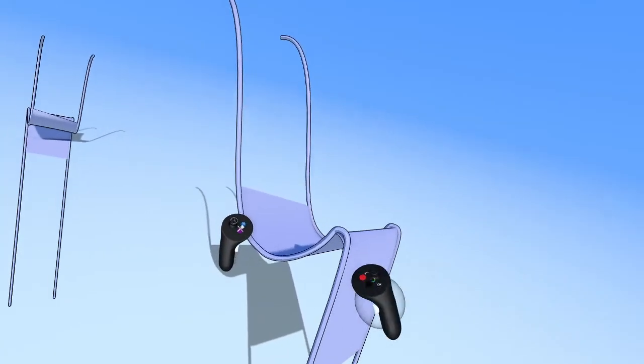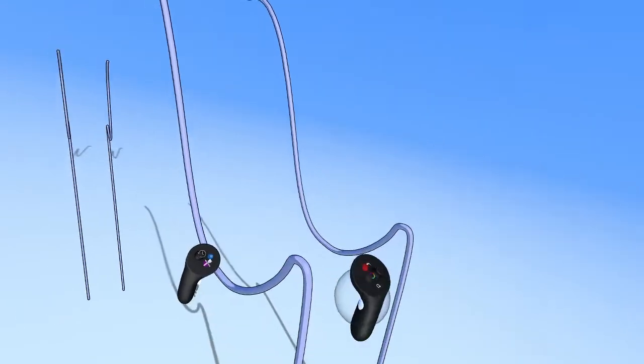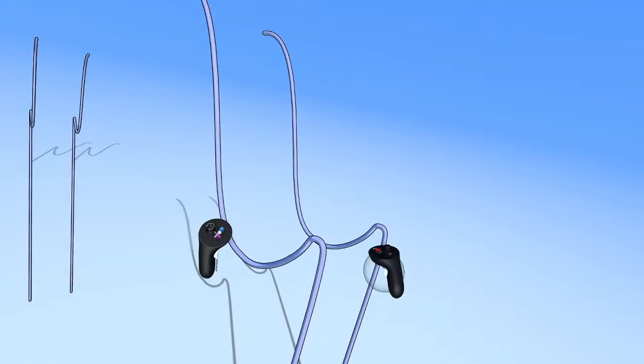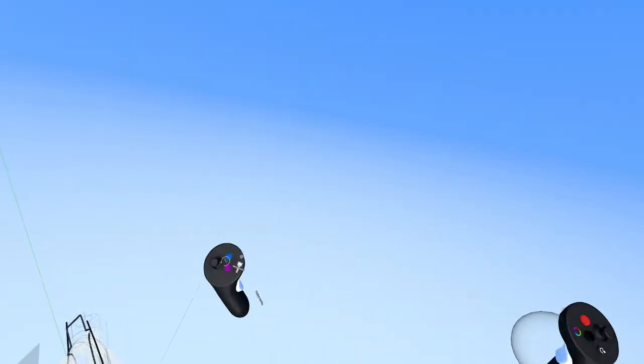In here, it's not too bad, and we can always put the surface into edit mode and adjust it, but keep in mind that if you're going to make a surface between two curves, you generally want to avoid using weighted NURBS.